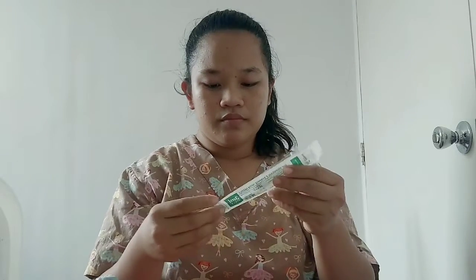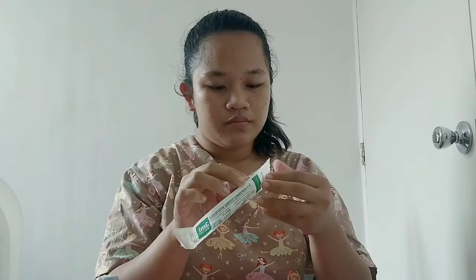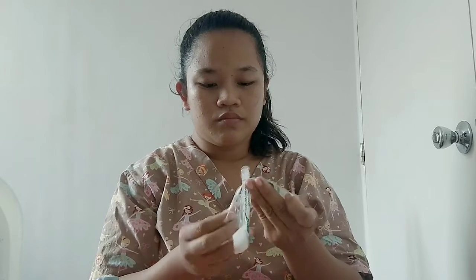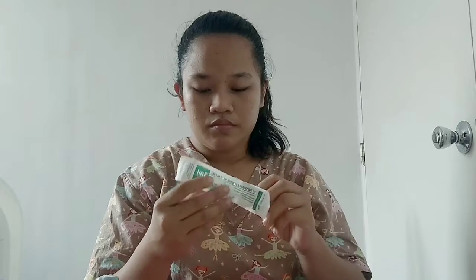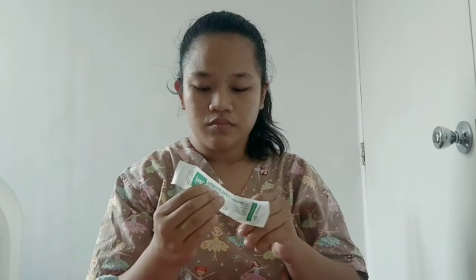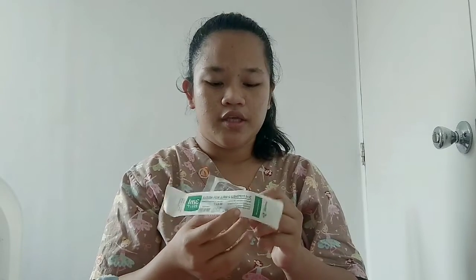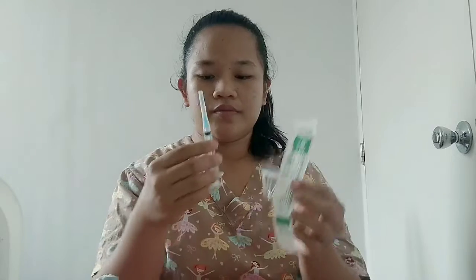First, we need to have a needle. Make sure that you only touch the plunger and the barrel of the syringe.